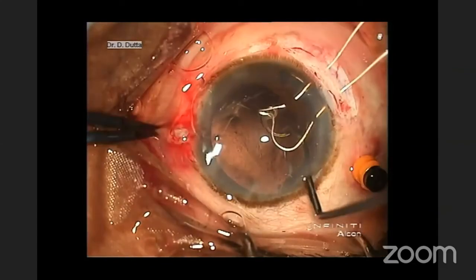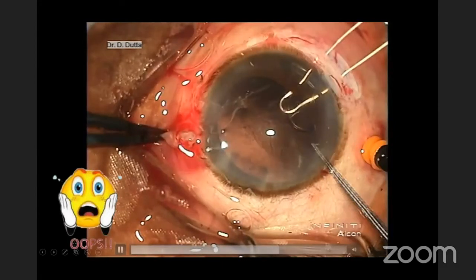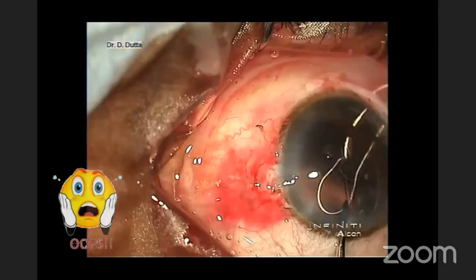Oh no, the suture has passed over the iris. Oh, doctor, what's the problem? Don't worry, it will be all okay.